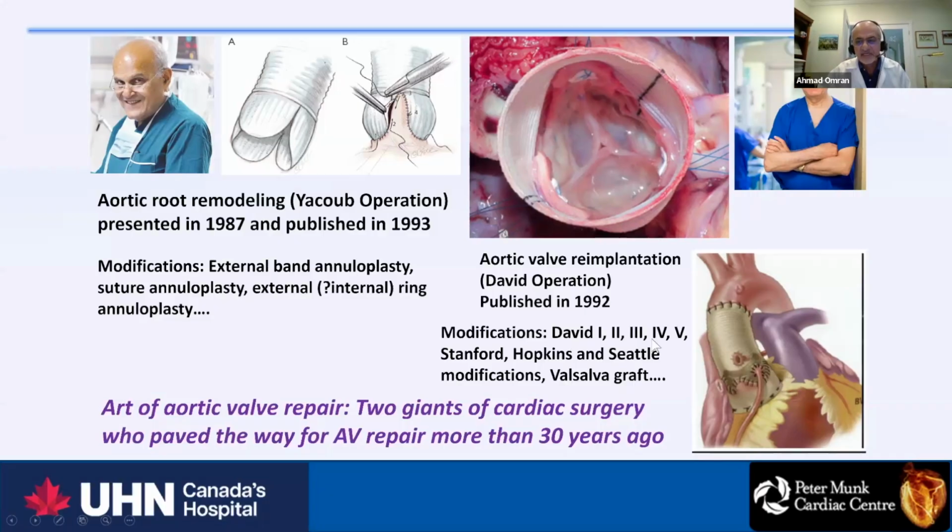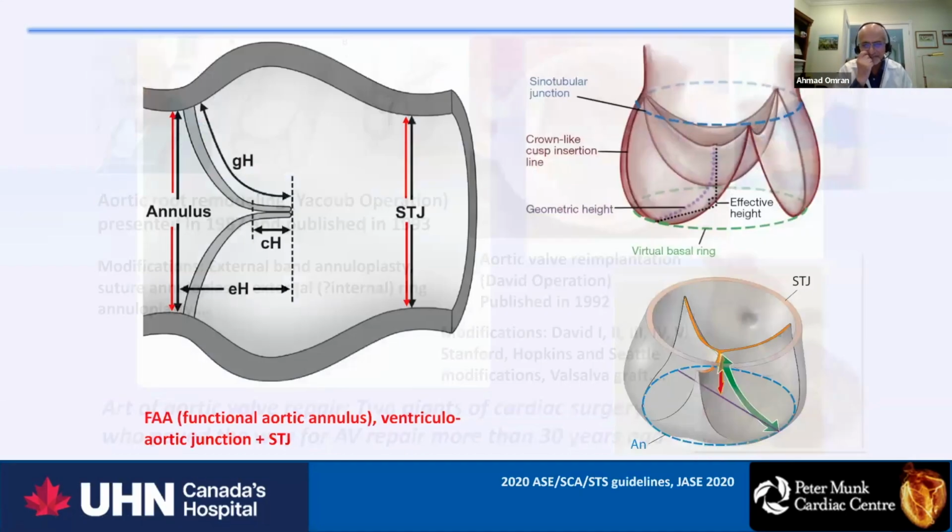There are many modifications, David 1, 2, 3, 4, 5. And I had a really great pleasure to be with him in that year. I started my fellowship in echo in 1992. So I have been with this valve repair and valve-sparing the entire process.